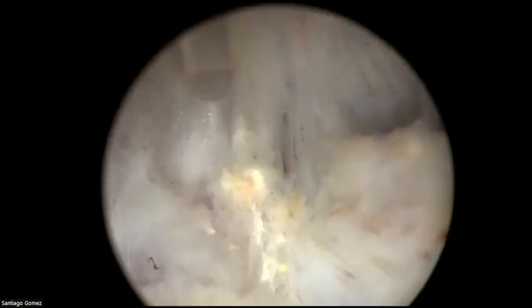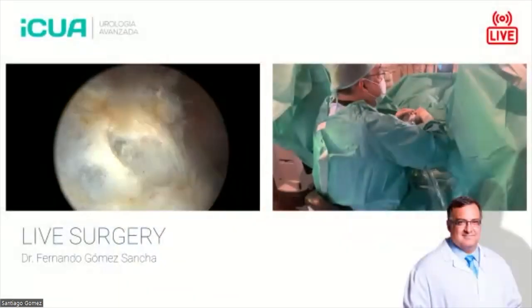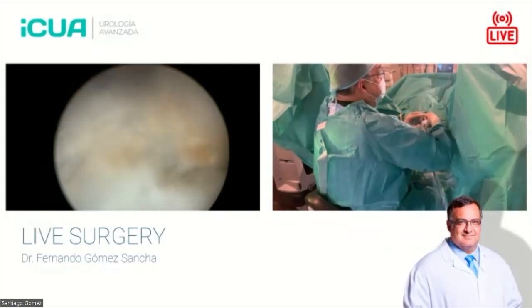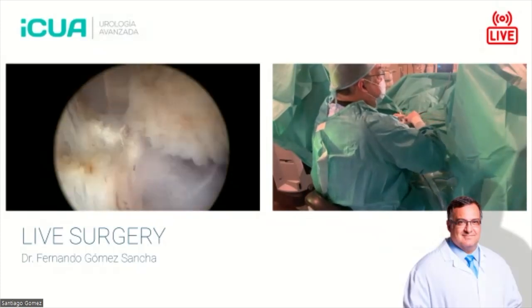You see, I'm seeing some BPH tissue here. That's why I'm going a little bit deeper, trying to find out. And also this looks like maybe there is some BPH tissue there. So sometimes you have to re-question or re-challenge your planes, and if you think that there could be BPH tissue, you have to deepen a little bit more. So that's how we drive the operation.